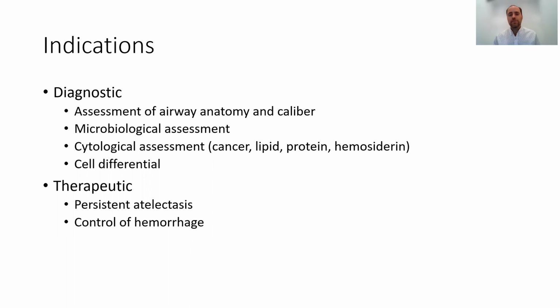It also has some therapeutic benefits in people with persistent atelectasis, like for example, a patient on ECMO for a long time for whom you need to resolve some atelectasis that's persisted for a week or two, and also in control of a hemorrhage. The vast majority of indications in children is for diagnostic purposes.